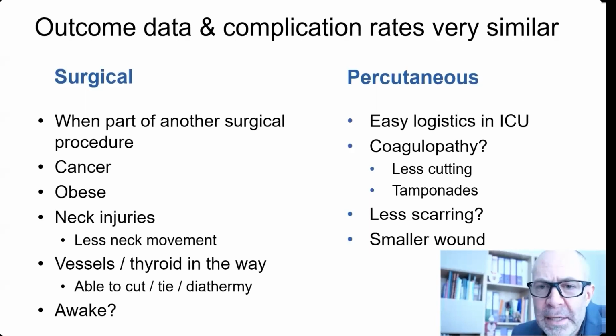Moving a patient who's critically ill to an operating theatre is a challenge for the patient, for the staff, and also the logistics involved in trying to find a theatre that's free, a theatre team that's free, and an anaesthetist that's free, and a surgeon that's free. And so just deciding this patient needs a tracheostomy and getting on and doing it is a huge benefit of the bedside approach. I think the jury's out on coagulopathy.